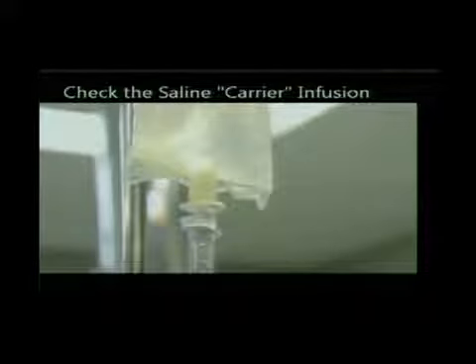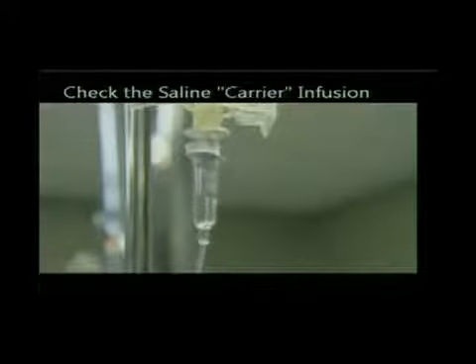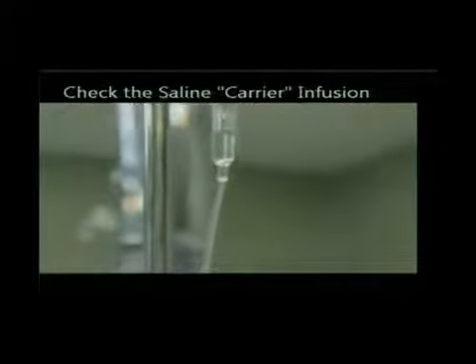Remember, I pulled this little white tab off and showed you the hole. This is the white plastic that's shoved through that so that this bag of saline infusion will drip into the patient. And you can watch it dripping by seeing the drops right here. You actually can see that it is running.